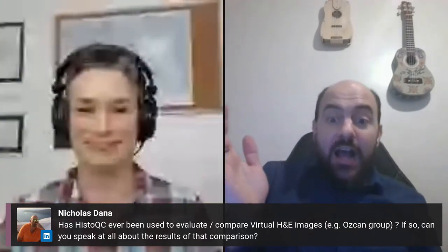But if you do have some information, like quality control metrics that are, by the way, deterministic, right? If you run that same slide 10 times, it's going to give you the same exact graph every single time. And I think that's really important, because now there's no variability. If I show you a slide and ask, is this within one standard deviation of what you're normally used to seeing? If you want, we can run this experiment. I don't think I will be able to answer this question.